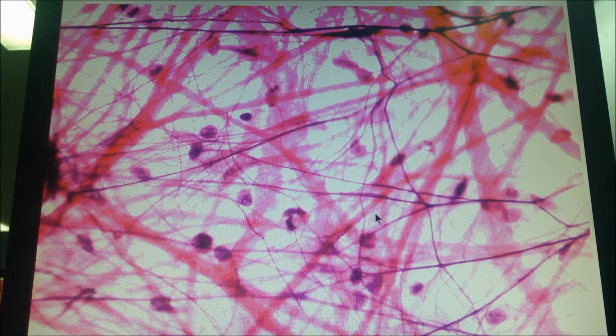The mesentery mainly is composed of loose connective tissue. نيجي نطلع هون. Loose connective tissue has a minimal amount of fibers, correct, but it also contains all the types. يعني not a lot of fibers, but all types of fibers can be found in the loose connective tissue. So what do we have here? The pinkish bundles, these are the collagen. The dark ones, the branched، هدول will connected with each other, these are the elastic fibers.